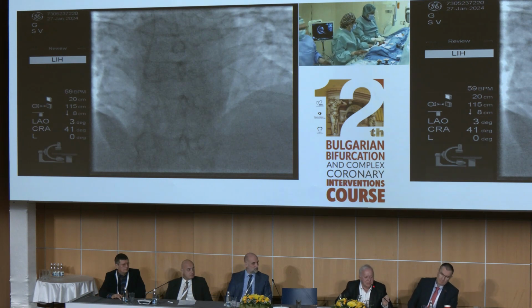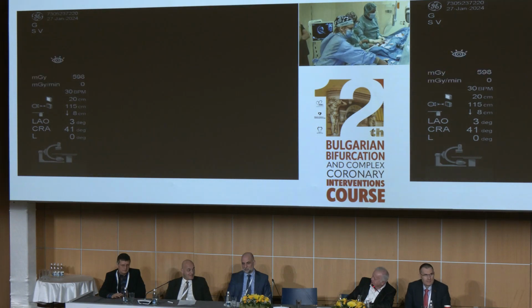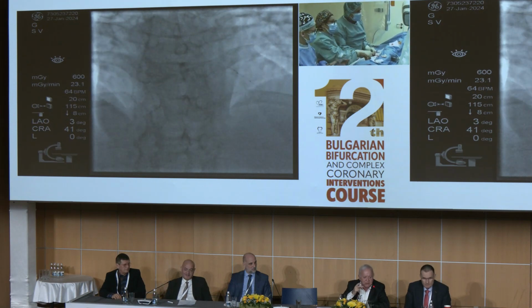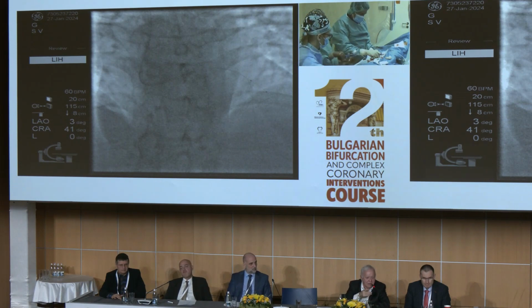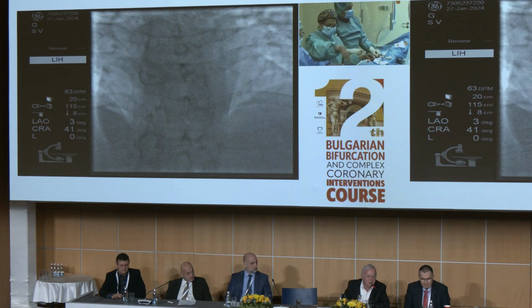Maybe we can discuss what to do with the diagonal, as it was suggested. I will share the position of my colleagues. This diagonal is the second one. It's not a very small one, but I don't think it is an important one. Personally, I will inflate at the ostium. I mean, I put the nose of the balloon inside the diagonal, no more, because if you push this balloon like this and you have a dissection, it will be longer.